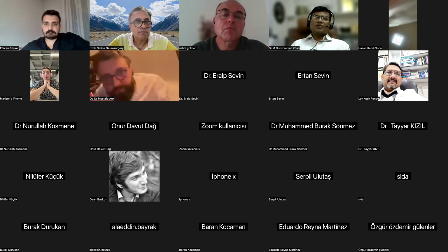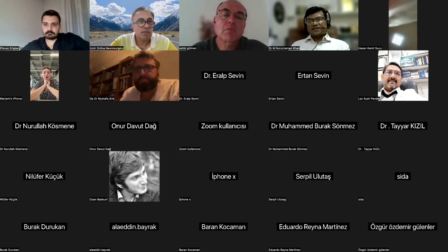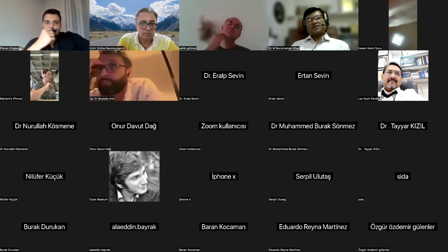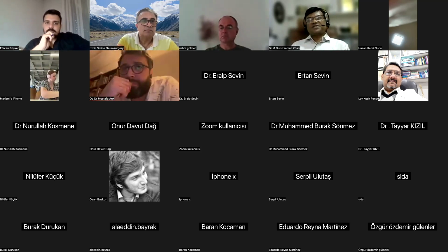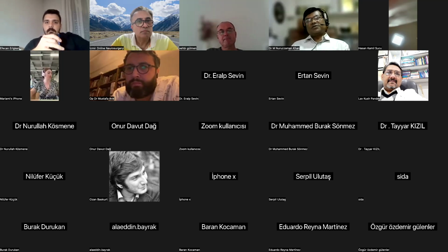Actually, I always prefer to stand on the symptomatic side. I'm a right-hand surgeon, but I always stand on the symptomatic side of the patient. And regarding the burr, I always use the diamond burr. I never use the cutting burr.